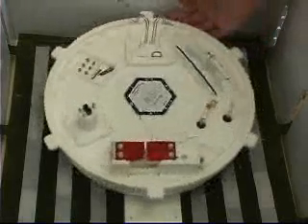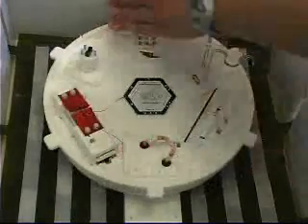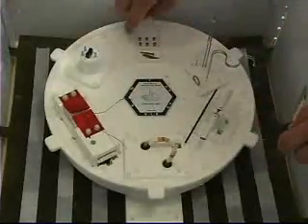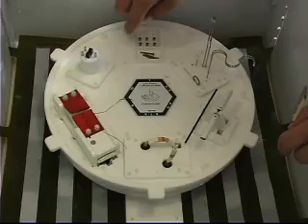The carousel is rotated to select the task, placing it in view of the camera, which is in a fixed position, avoiding the need to readjust the camera after each task.